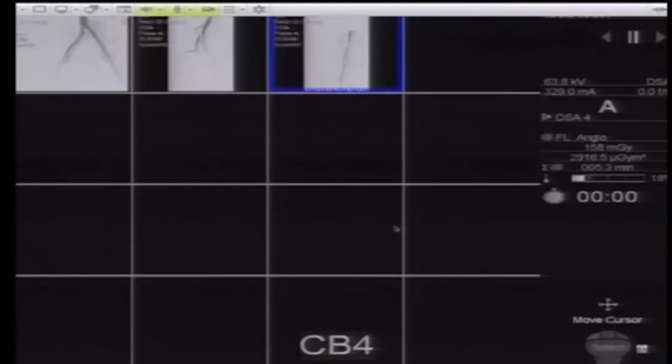Before we can do anything, we've got to connect those dots with the wire. That wire will tend to go down all the little open branches. What you really want to be able to do is hold it steady and drive that wire right through the middle of the blockage and get the wire down to the other end. Once we've done that, then we can take whatever device — be it a drill, a catheter that chops out clot — and drive it down over that wire to open up the tube.